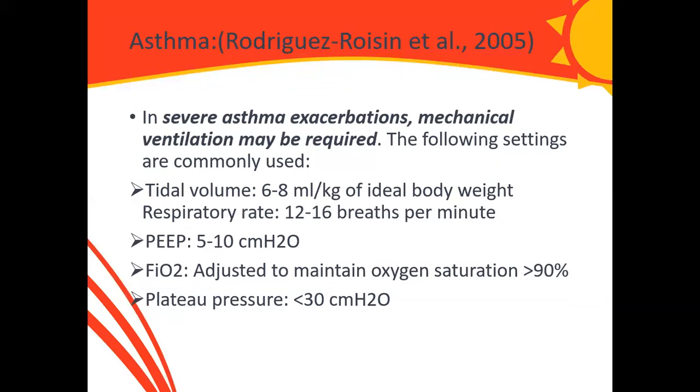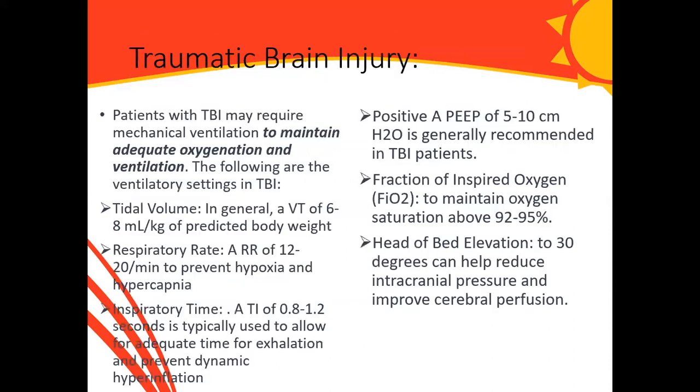In severe asthma, we can have some exacerbations that will require invasive mechanical ventilation, and it's almost the same as that of COPD, except that the respiratory rate may be a little higher.